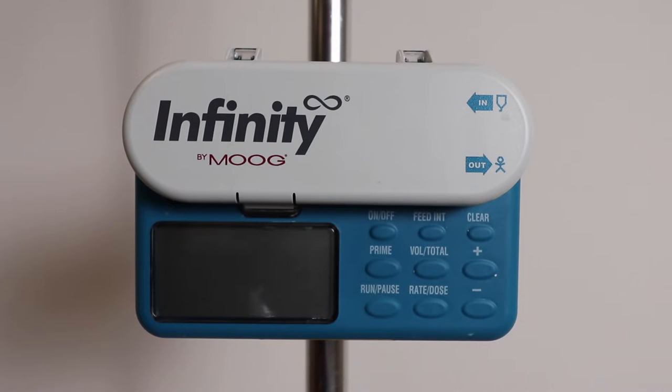Today we're going to be going over the Infinity Feeding Pump by Moog.